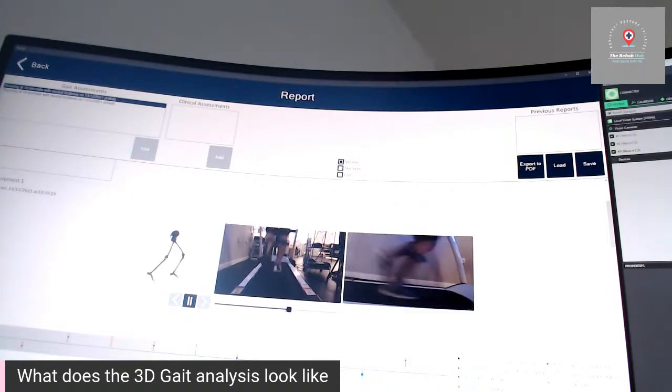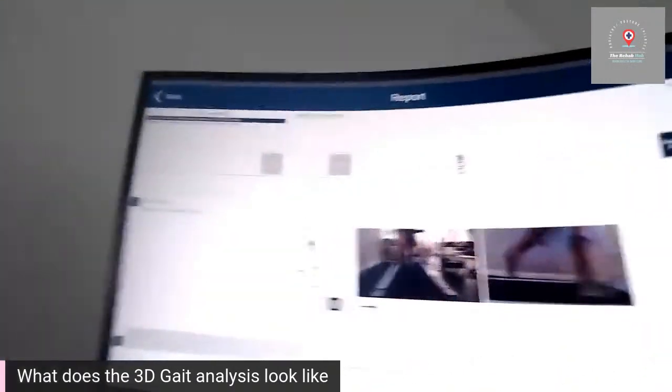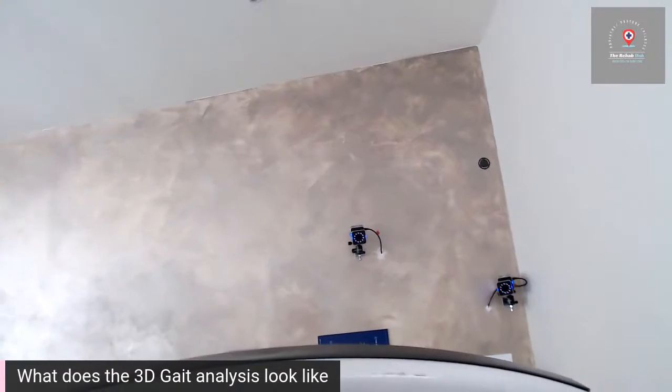So you can see on that left-hand side, there's a little skeleton that's been created, and that's actually the client's skeleton that we have pulled in from the infrared cameras. So I'll spin this round to show you what I mean in terms of the infrared cameras. Hold on a wee second. So if we just look over there. So at the back there, you can see there's cameras on the wall.